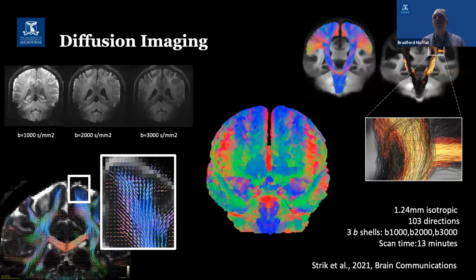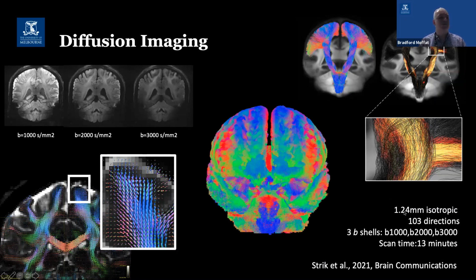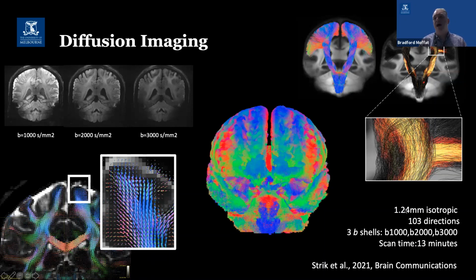The other thing that I alluded to is that we can do fantastic tractography, and we can do this at 7 Tesla, where we can really map the connectivity between different areas of the brain by the white matter structure. So here we've mapped the corticospinal tracts, and of course we can do whole brain tractography using MRI, and we can really push the spatial resolution. Usually diffusion MRI and tractography is done with a resolution of about 2.5 to 3 millimeter isotropic, and we can certainly get down to half that in all 3 directions.